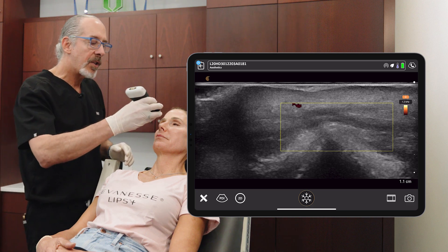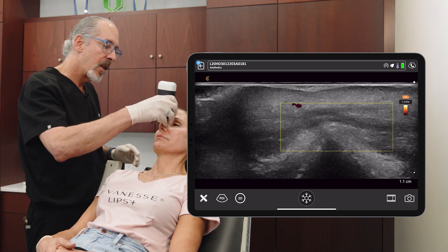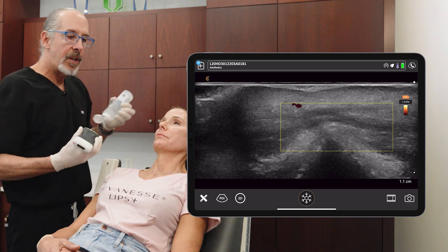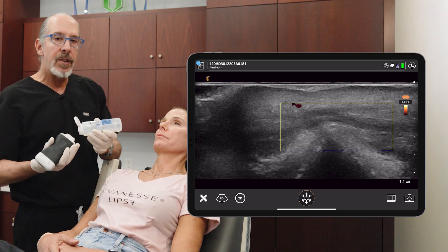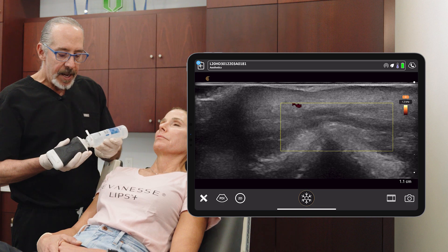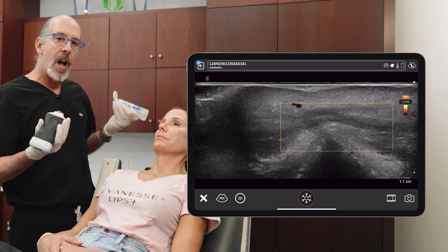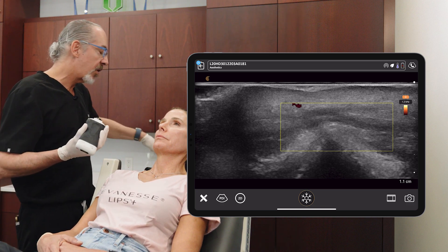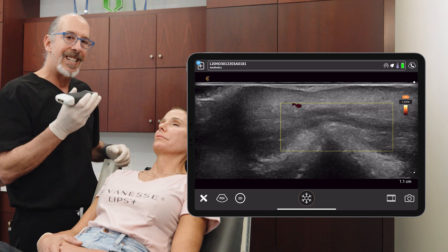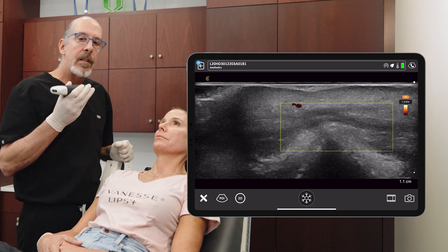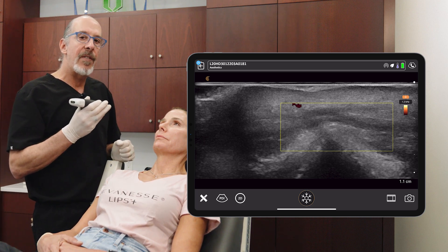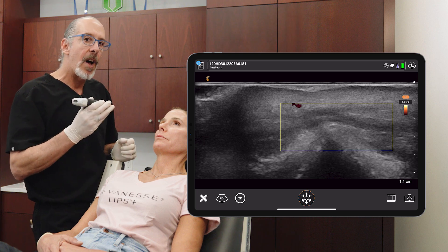The best way to evaluate the nose is actually in a horizontal fashion. In this case, you do an offset. An offset means that you put so much gel on the ultrasound that you're actually not touching the skin. That lets you not apply any pressure to the vessels, so you're not crimping them off.